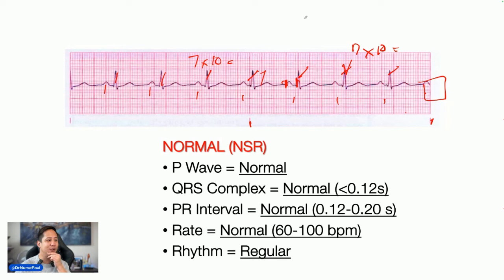What's the reading? What do you call this? Don't say sinus rhythm, all right? Because sinus rhythm is also bradycardia or sinus tach or sinus arrest. I'm not even going to talk about that today. Normal sinus rhythm. You always say NSR because sinus rhythm can be many things. You got it? Understood, nurses?